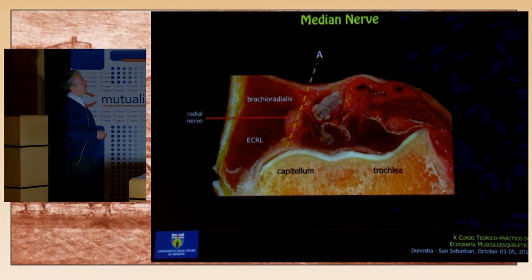may leave you some doubts, some perplexity. When you place the probe over the wavy course, the wavy appearance of the distal humeral epiphysis, this is a very important sonographic landmark to identify the different structures in the anterior elbow.